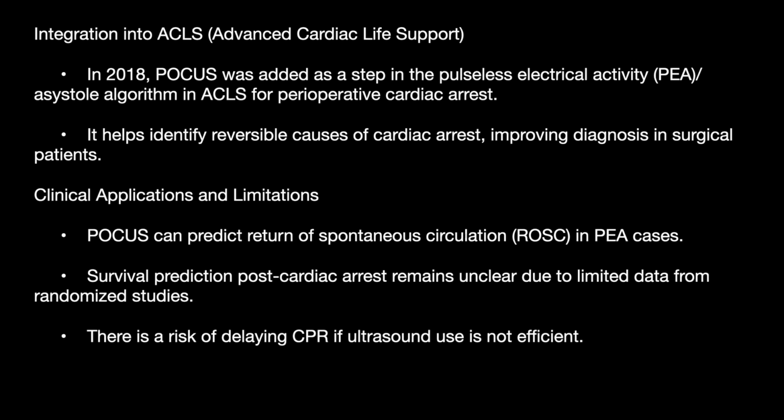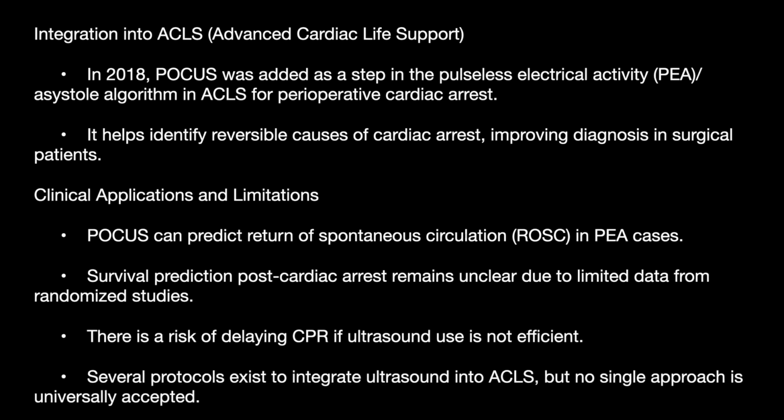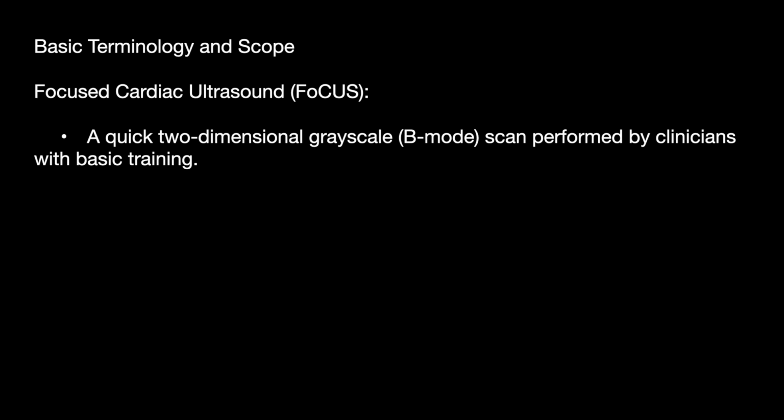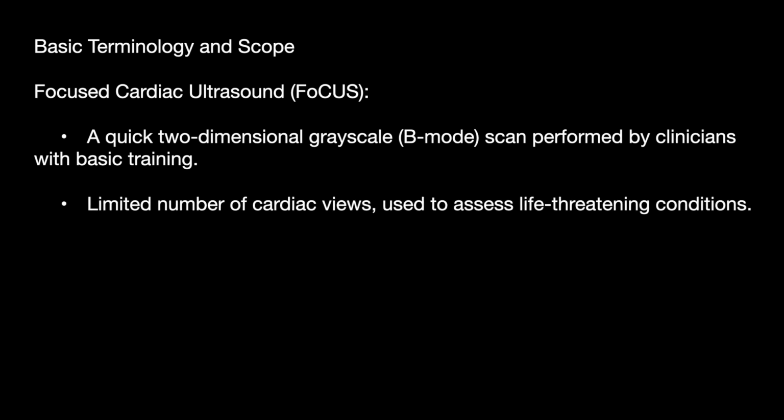There is a risk of delaying CPR if ultrasound use is not efficient. Several protocols exist to integrate ultrasound into ACLS. Now there are some basic terminologies like FOCUS, that is focused cardiac ultrasound. It is a quick two-dimensional grayscale B-mode scan performed by clinicians with basic training. A limited number of cardiac views are used to assess life-threatening conditions.